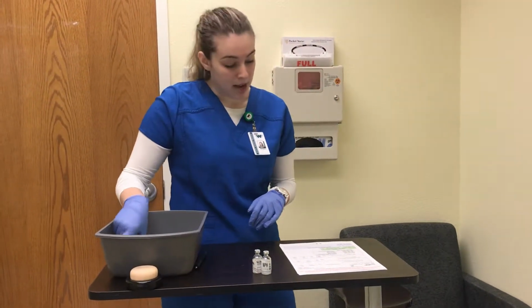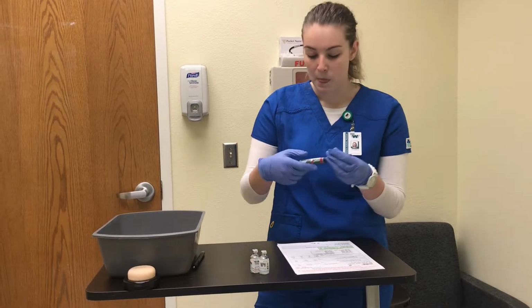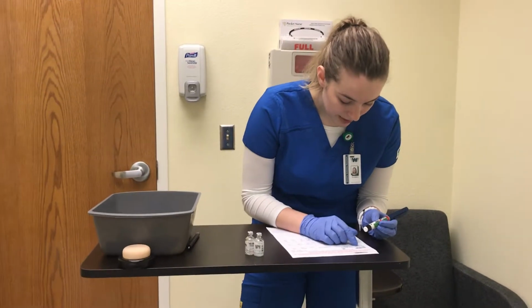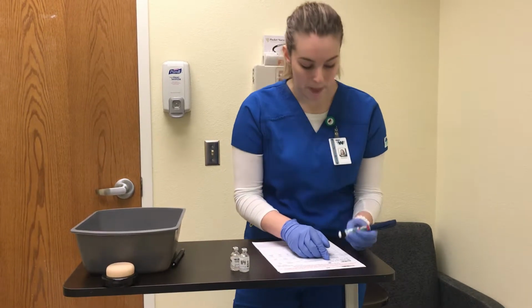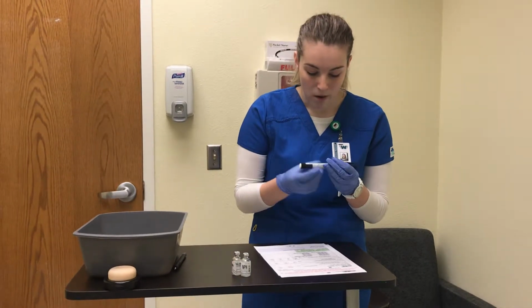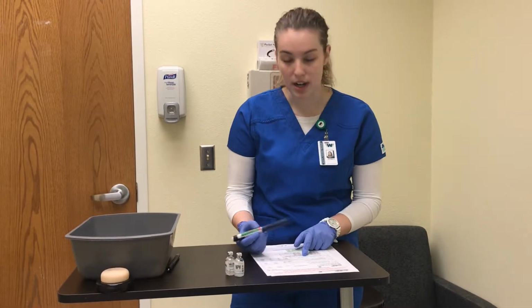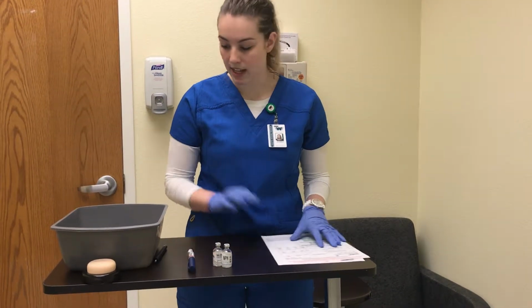So next I have my insulin pen. So I need my Practi Insulin Lispro U100 insulin pen. And first let's make sure I have the right patient. There it is, Shirley Coast, 54, 5/14/64. Dr. Leo, 211-1. Perfect, so that all matches up. So I have my Practi Insulin Lispro U100 insulin pen. So now that I have all my medications, I can begin with my second medication check.